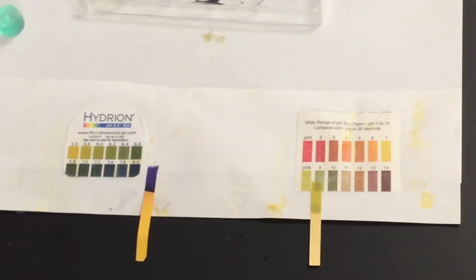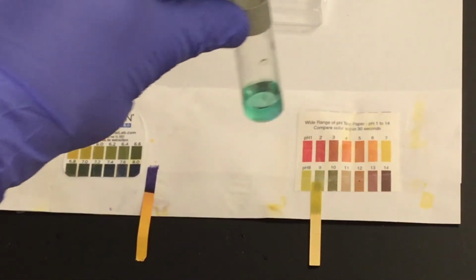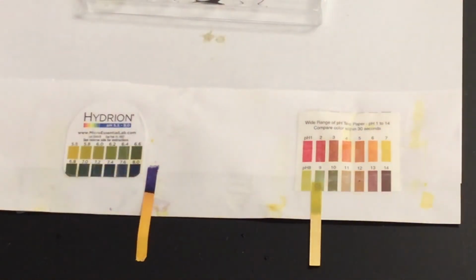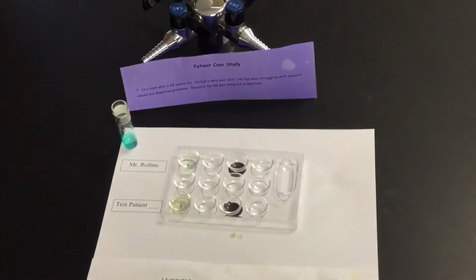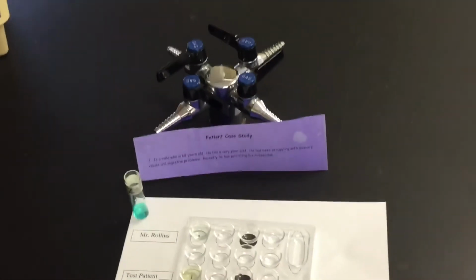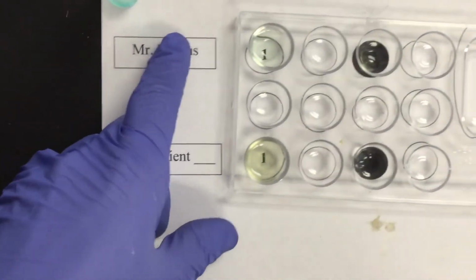Now we need to add our Benedict solution to our sample. So we added it to our sample. It looks like this color. We're going to put that on heat, and we'll come back with that in a few moments. While that is in heat, we want to test our other samples in terms of the chemistries. And as you can see, we have Rollins across the top. We have test patient number 7 along the bottom.